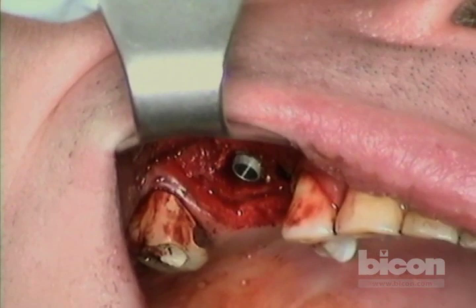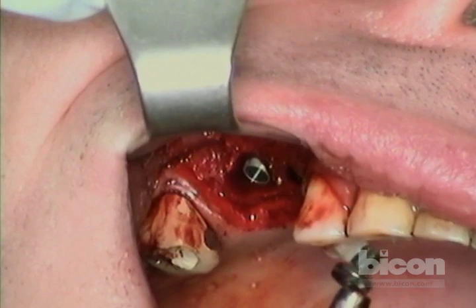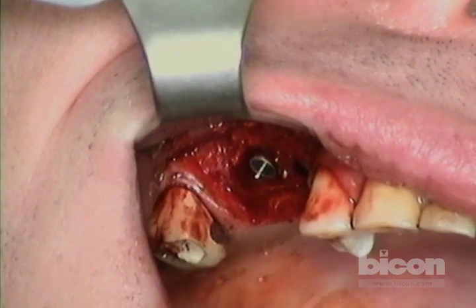Now we'll put in the sinus lift abutment. The easiest way to hold it is with the suction — you have the best control and visibility — and I want to put it with the widest part against the buccal and palatal.